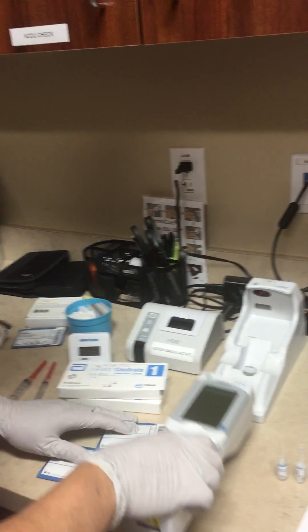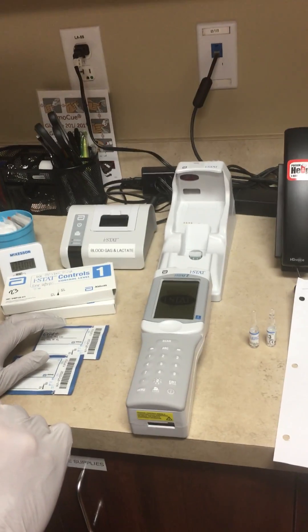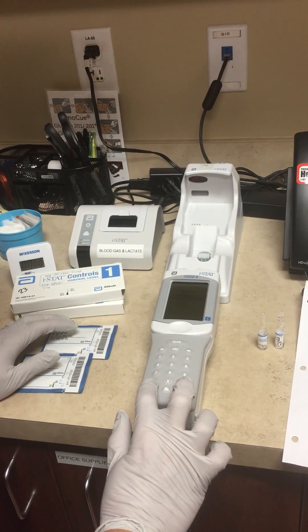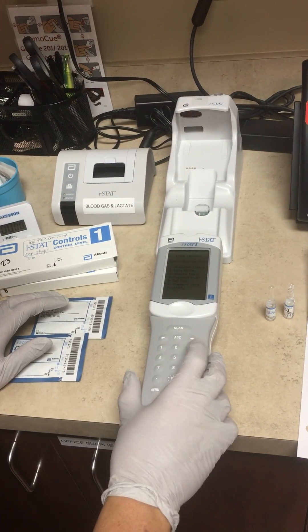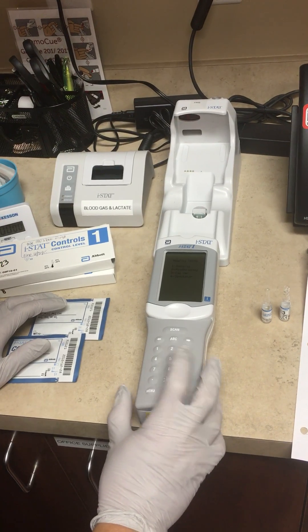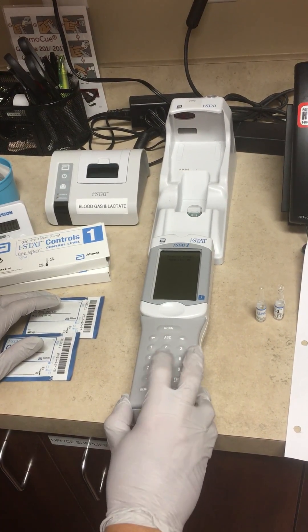We'll turn the I-Stat on. We're going to touch the menu button, then go to Control, push 1 for Control, and enter our operator number.